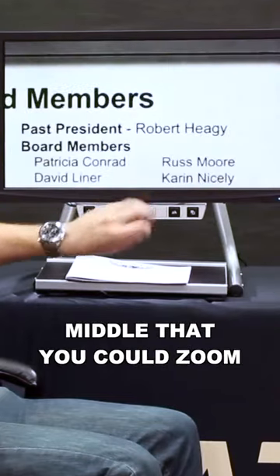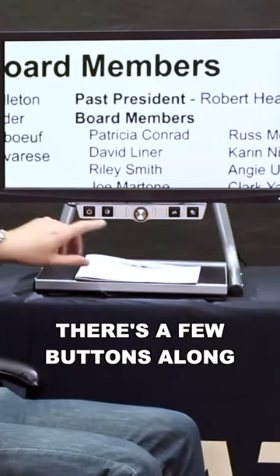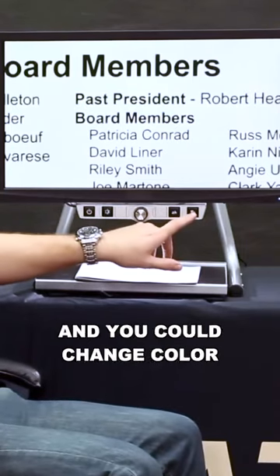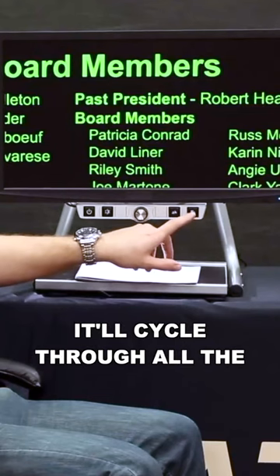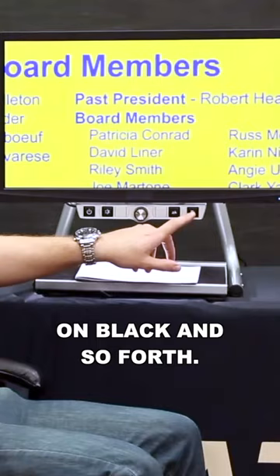There's a dial along the middle that you can zoom in or out with. You could also change color modes — there are a few buttons along the bottom here. You can change color modes by pressing the bottom right button. It'll cycle through all the different colors like green on black, yellow on blue, white on black, and so forth.